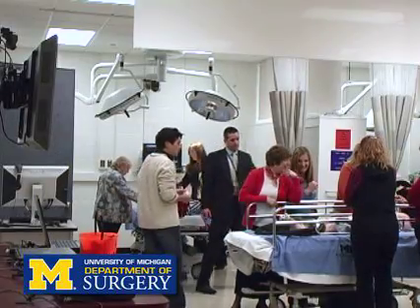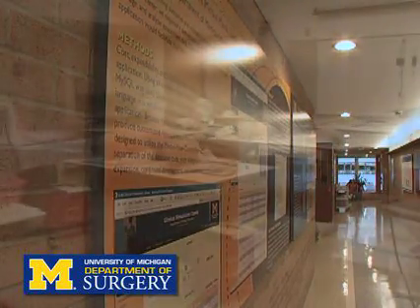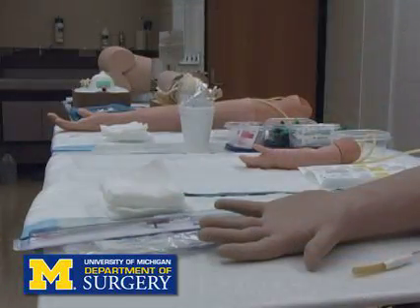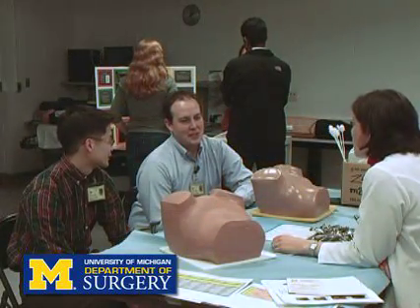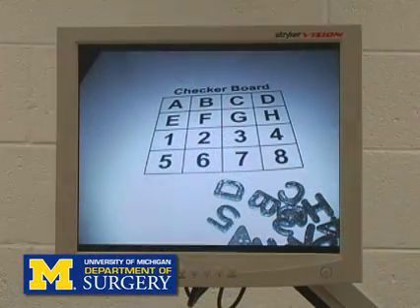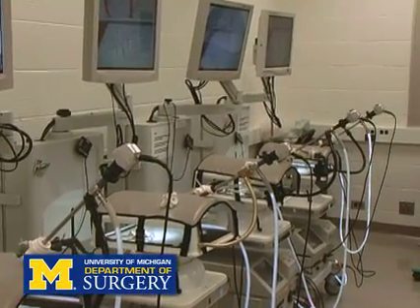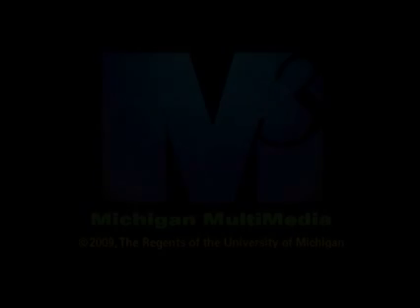We need to think constantly about new ways of making the educational process not only more efficient but much more effective. As you'd imagine, such an effort is incredibly expensive. It's difficult to support this in an era of cost constraints on medical practice and medical education. But it's clear that simulation technology is here to stay, and it's a critical part of how we learn and train today. It's a critical part of developing our individual skills. It's an absolute necessity for developing our team skills. The University of Michigan really needs to maintain its position at the forefront of this effort in determining how these technologies and how these standards will evolve in the future.